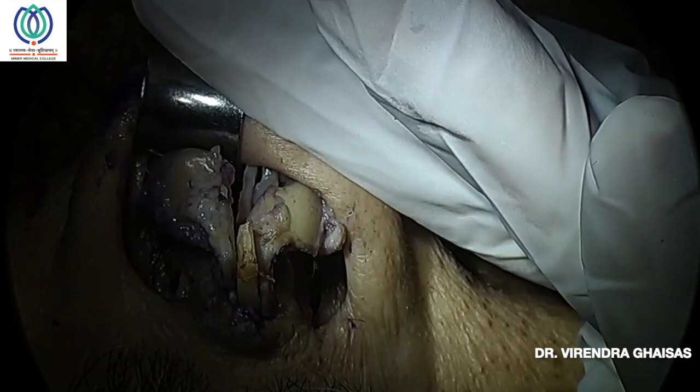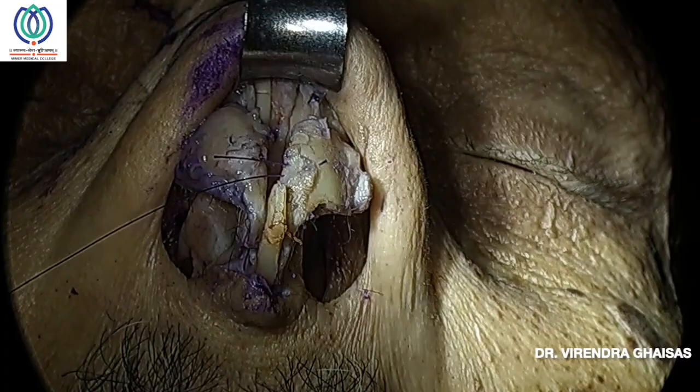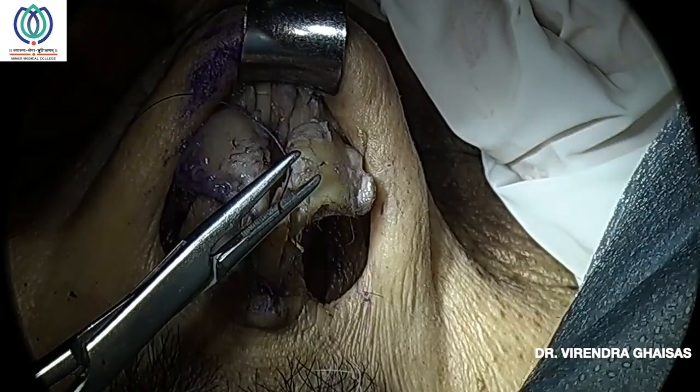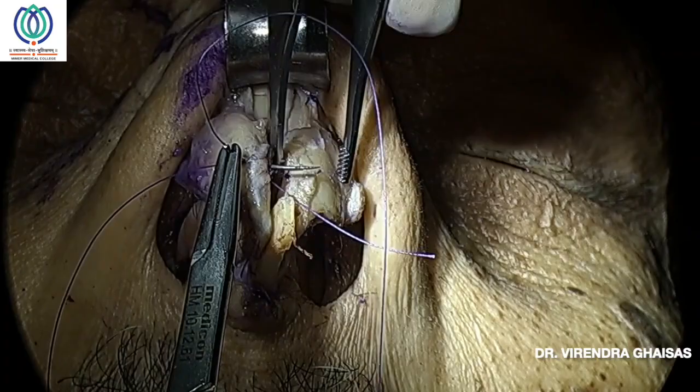So you go from medial to lateral, then lateral to medial, you cross on the opposite side and then come back. So the knot is in between. This will create a dome. These dome creation sutures are interdomal sutures and intradomal sutures. Now an important key point is that you should not make these knots very tight, otherwise it will give a pinched appearance.